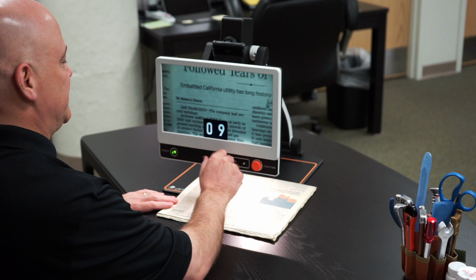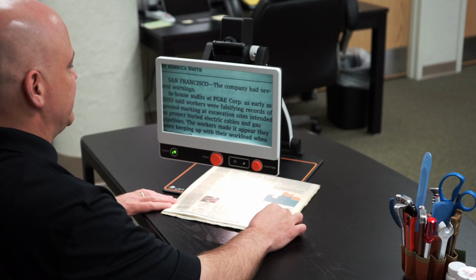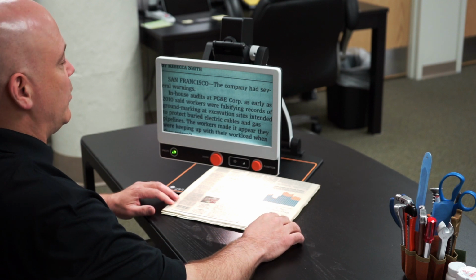So then what I'm going to do is just enlarge the column that I want to read so that it fills the screen. For those of you who have heard me speak before, you always want to do that. You want to take your magnification and fill the screen. You don't want to invest in equipment like this and then not fill the screen with the size of your print. So if you are able to see it at a smaller size, even if your vision is 20/20, we all read one column at a time. So take that one column, whatever column that is, and fill the screen. So here we have the screen filled with that one column.